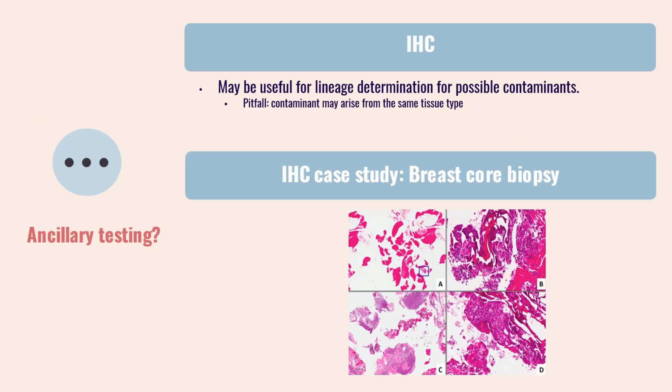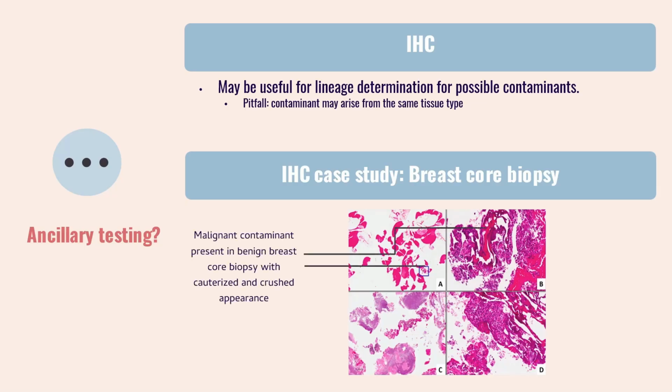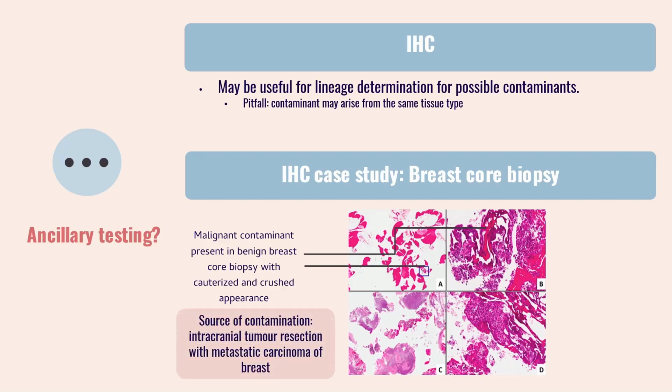Ancillary testing may be required in some situations to clarify origin of contaminants. Immunohistochemistry is one tool which may help for lineage determination. However, remember that a pitfall exists, as contaminants can arise from the same tissue type. Take a look at this case for example, where a malignant contaminant was found in a benign breast core biopsy. Note that this fragment was again cauterized and unusually crushed. It turned out that this contaminant came directly from an intracranial tumor resection for a metastatic carcinoma of the breast. Immunohistochemistry for lineage determination would not be helpful and even potentially misleading in this scenario.